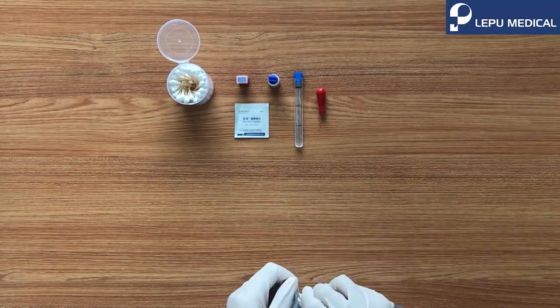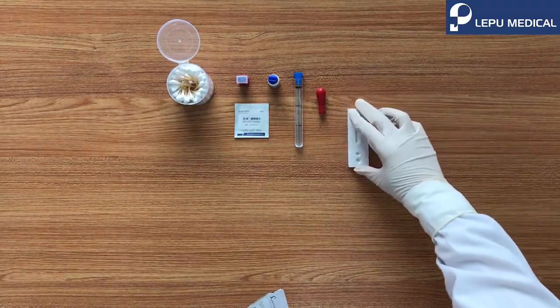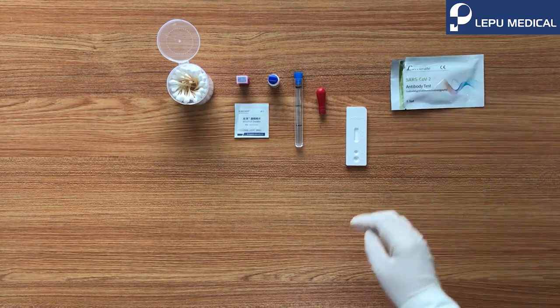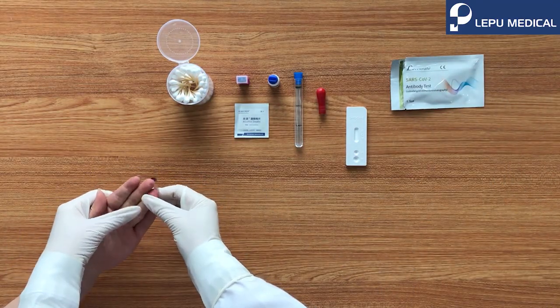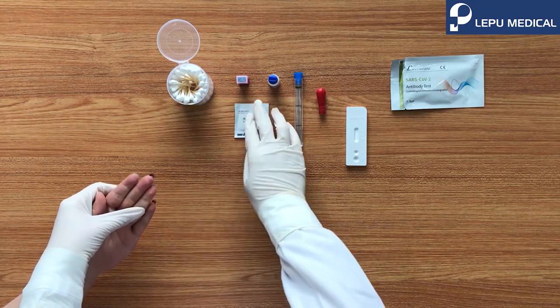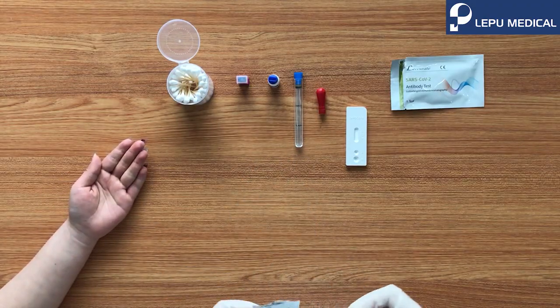Open the pouch, take the card from the pouch, and lay it down on the table. Massage the finger smoothly. Use the alcohol swab to clean the finger.